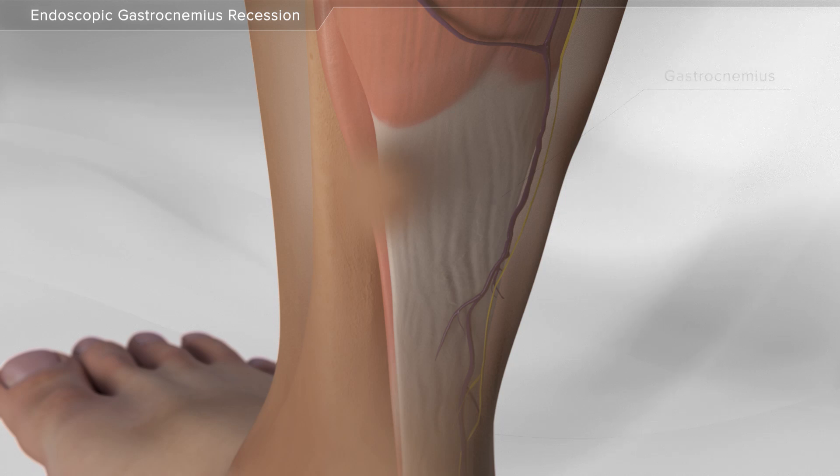With the ankle held in the neutral position, your surgeon makes a small incision on the inside part of the calf.